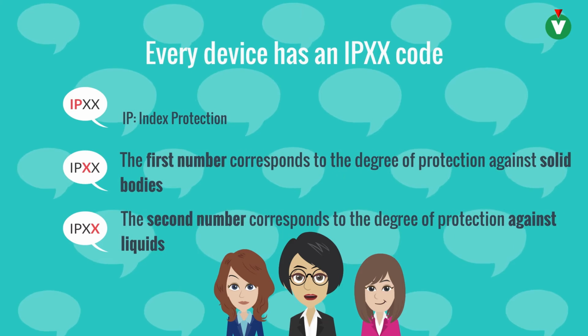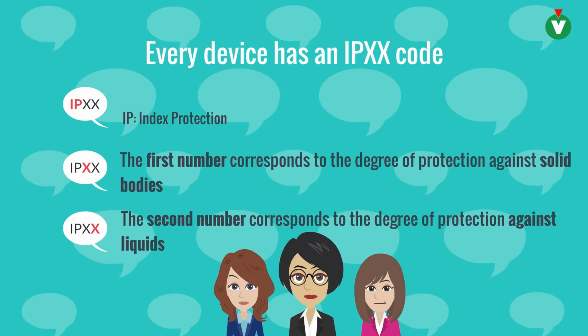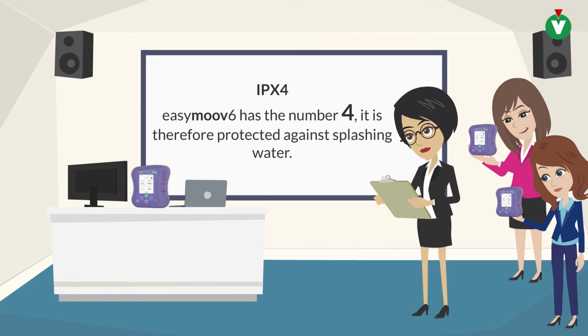Every device has an IPXX code. IP stands for Index Protection. The first number corresponds to the degree of protection against solid bodies. The second number corresponds to the degree of protection against liquids. The pump has the number 4, it is therefore protected against splashing water.